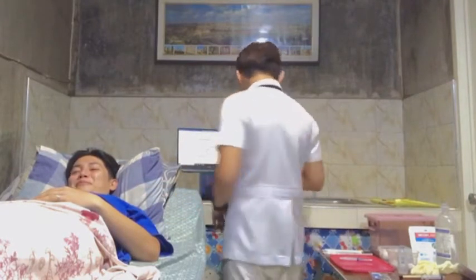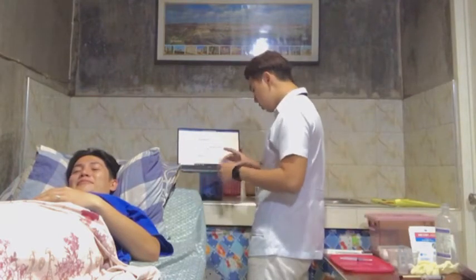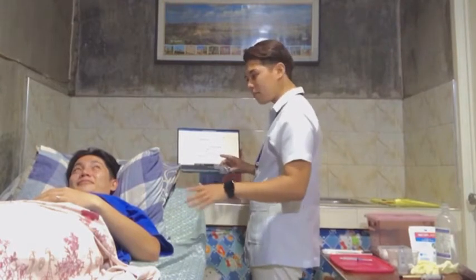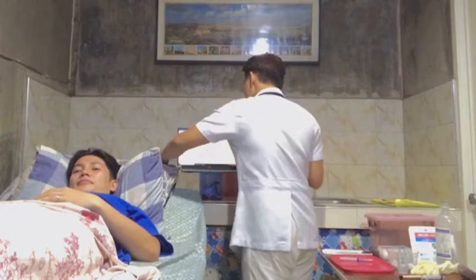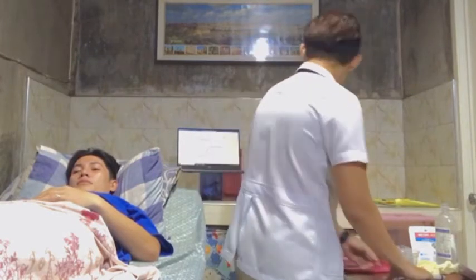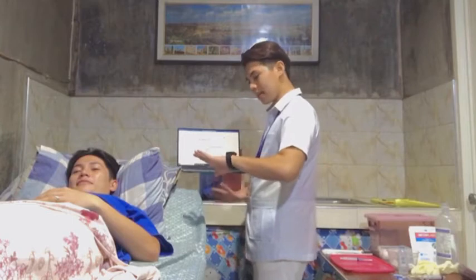The right medication is sodium chloride in ampule. So the right dosage, we will be administering 3 ml for the patient. And let me just verify this one here first. The right route is intramuscular, and the right time is every 6 hours, 10 a.m.